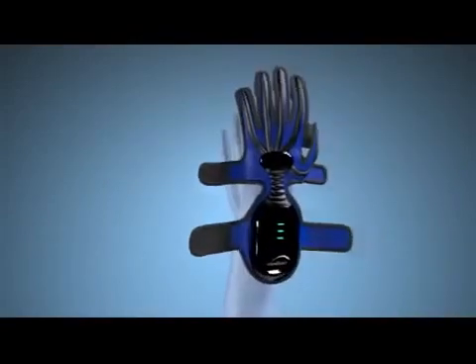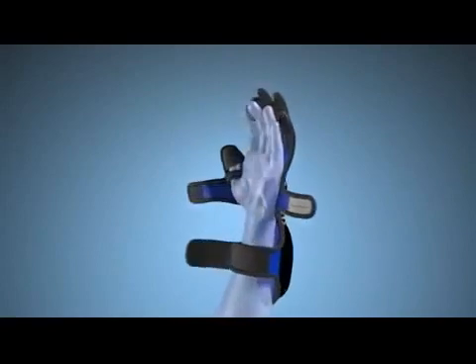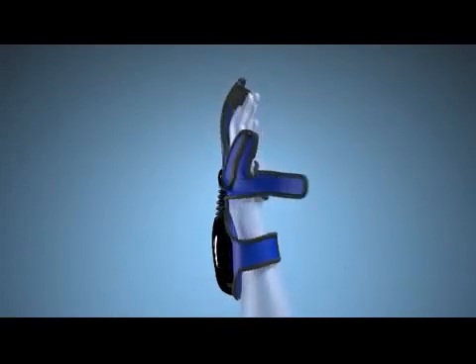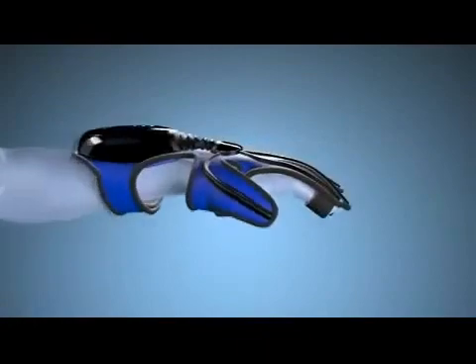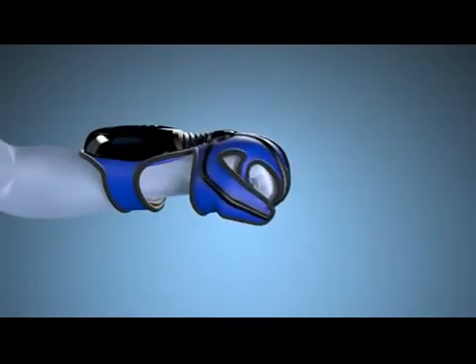The HandTutor system consists of an ergonomic glove that is easy to put on, even if the patient has severe hand movement limitations and limited range of motion. The glove is comfortable and easy to use during hand exercise treatments and movement evaluations. The HandTutor allows for full movement of the wrist and fingers and does not limit the patient's range of motion.